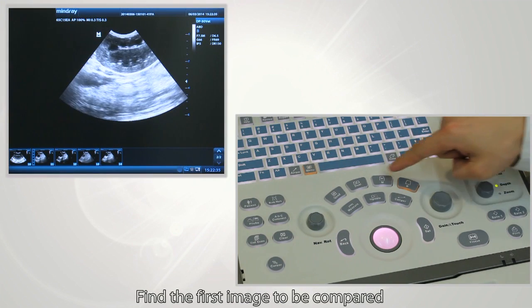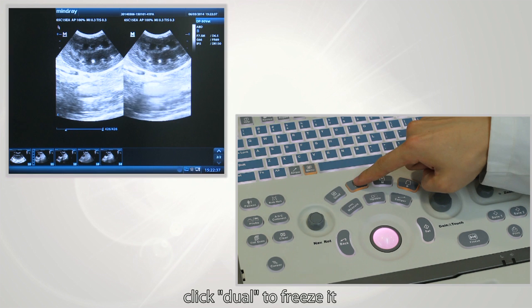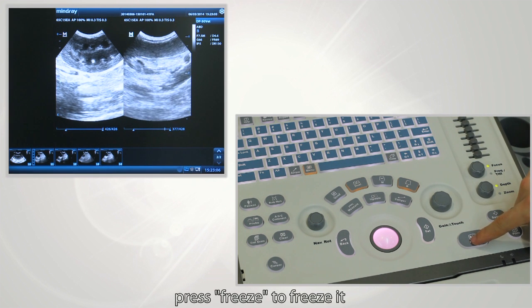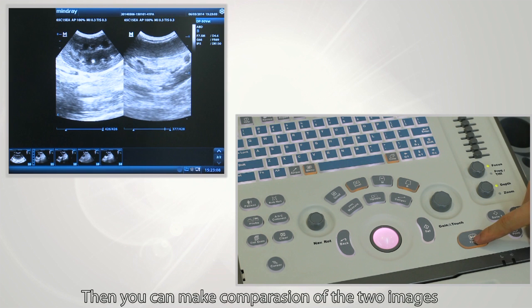Find the first image to be compared and click Dual to freeze it. Then find the second image to be compared and press Freeze to freeze it. You can then make a comparison of the two images.